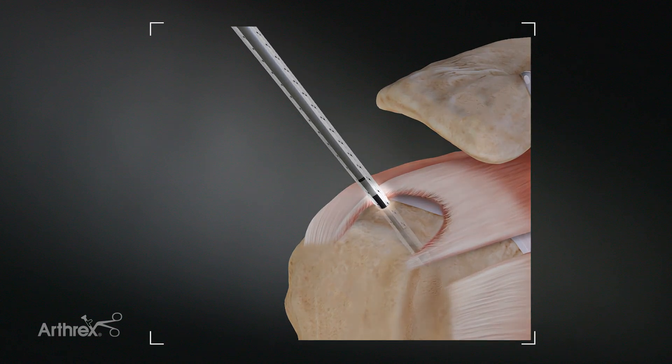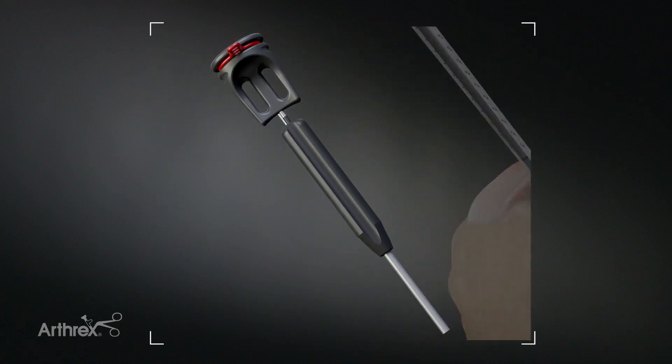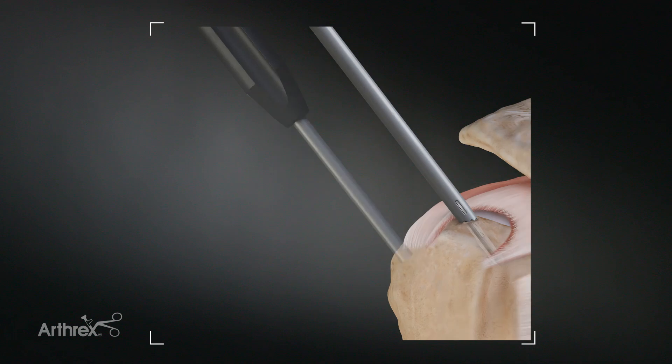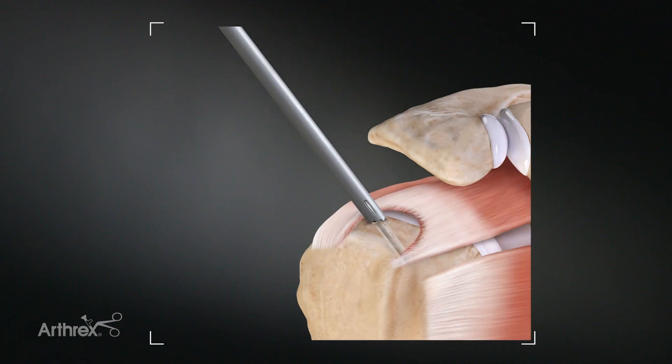You can utilize laser marks adjacent to the bone for placement without a guide, or laser marks more proximally when it is placed with a guide. This self-punching aspect is very nice because it simplifies the steps for rotator cuff repair.